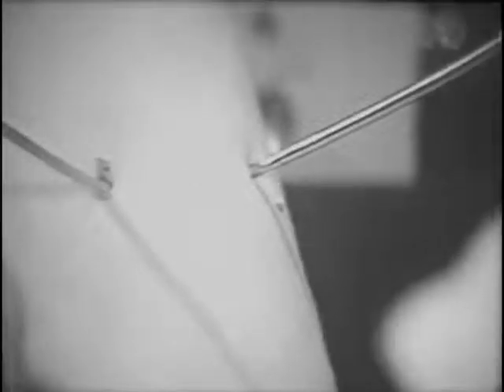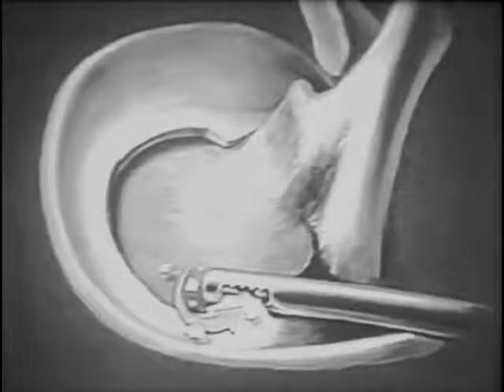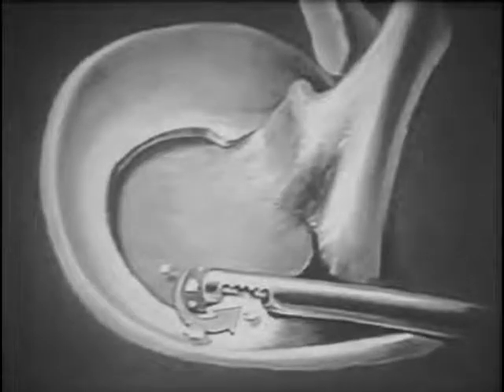An arthroscopic view shows the nerve hook probing an anterior portion of the remaining meniscus. This area is frequently a problem and is difficult to reach with an instrument. When those difficulties are encountered, the chondroplastic shaver is an excellent tool to reach this area easily. The chondroplastic shaver can remove all loose fragments as well as rough edges of the meniscus that would cause difficulty for the patient.